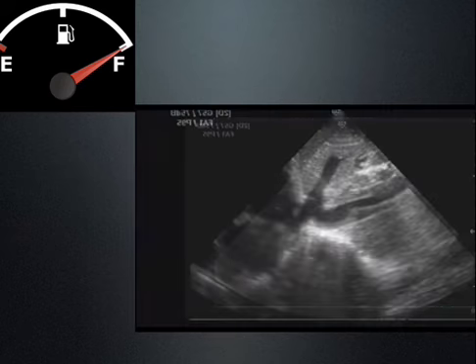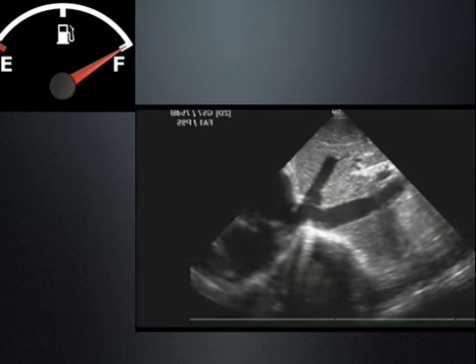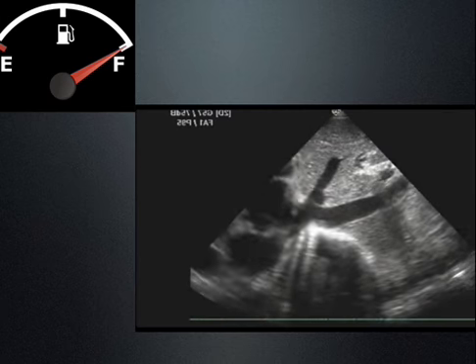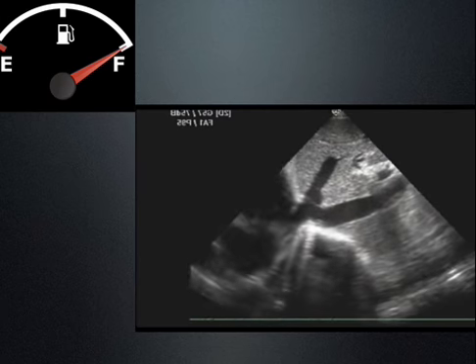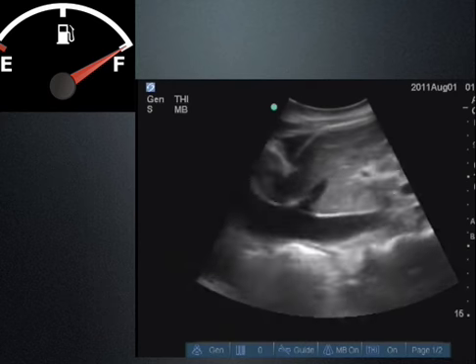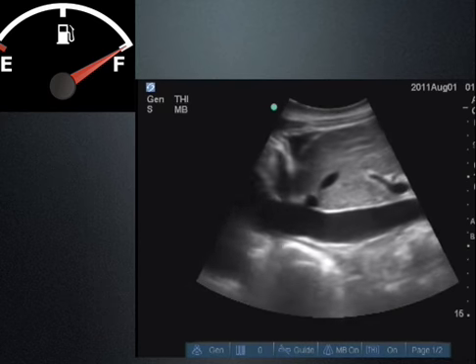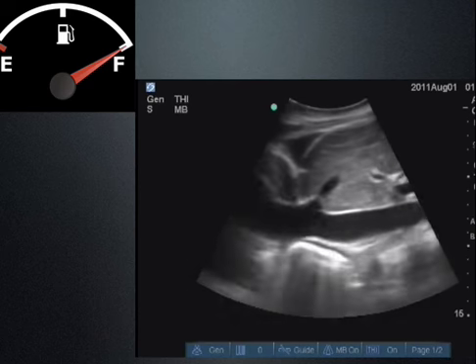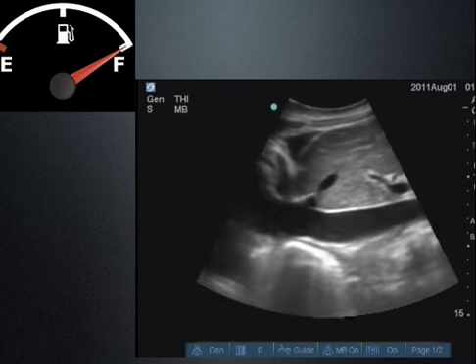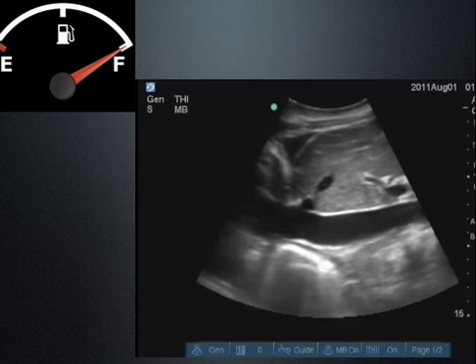Okay? Here's another one. So our hepatic vein coming in. IVC here, we can see right atrium right here. Not a lot of diameter variability. And one more. This one has, I don't know, 5–10% collapse. If you look very, very carefully. Doesn't really matter what percent collapse, right? It's large, all right? Minimal diameter change.